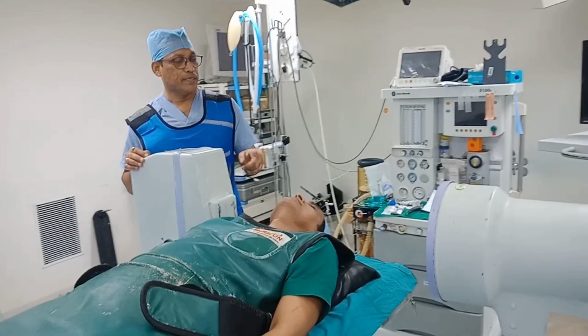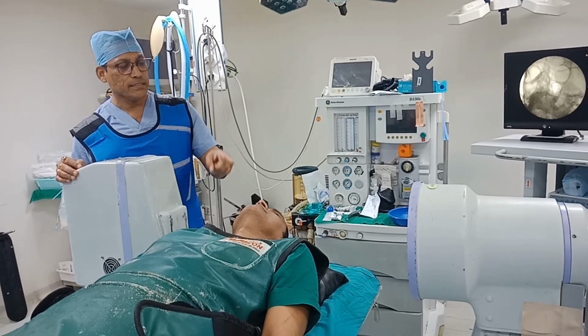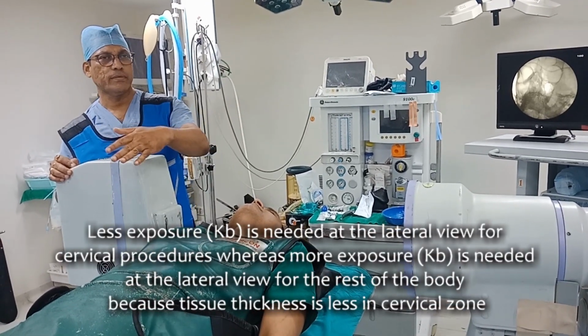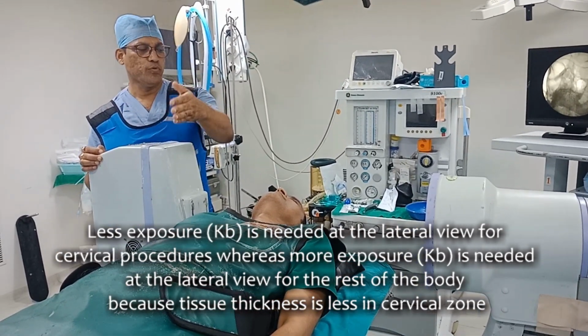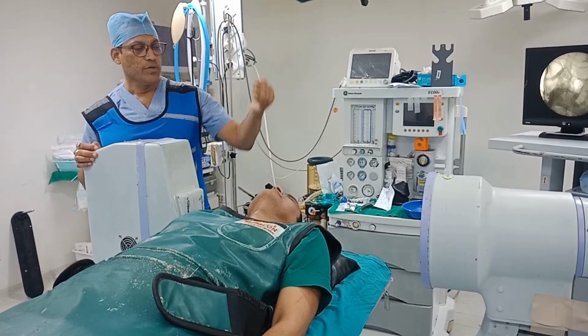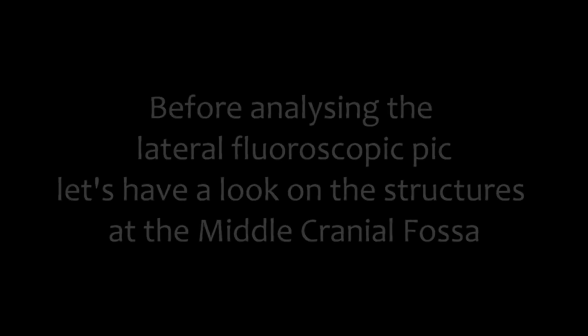So we'll see now. When you are doing lateral, particularly in head and face procedures, keep in mind that kV will be less in lateral and more in AP oblique. Whereas in the whole rest of the body, when you come to the lateral view, the exposure needed is more than in AP view, but at the cervical level, the exposure is less in lateral view and more in the AP view. Now we see the lateral picture.